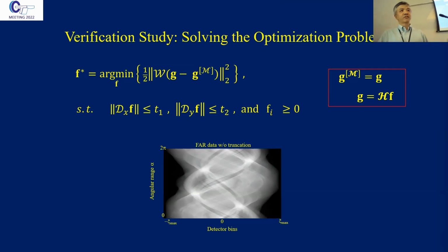Theoretically you can prove it solves this problem, but one thing is that when the iterative algorithm solves a data-divergence model, actually there's no approximation. It's the implementation of the algorithm. In the computer code, it's exactly the same. So at least you have to verify your computer code is doing what you're saying it's doing. So here we're going to do some numerical study to verify it, and for simplicity, we assume the measurement data in this verification study is just model data. We generate the simulation data that we plug in.